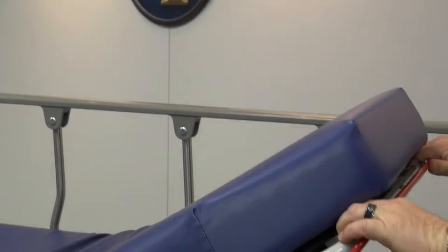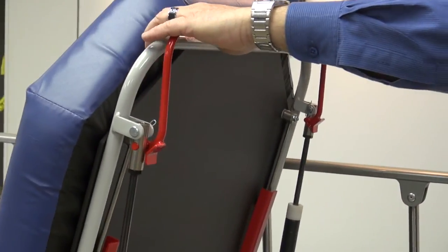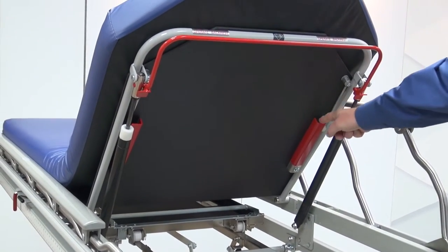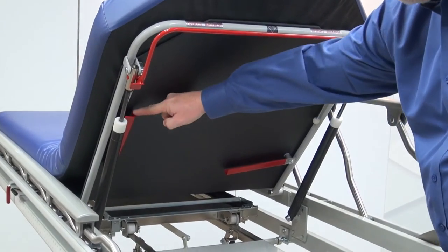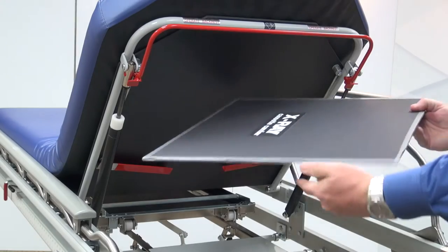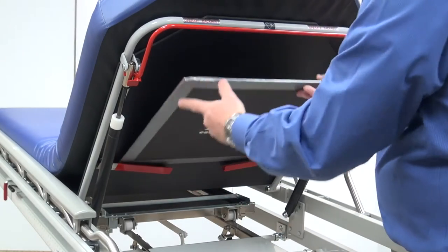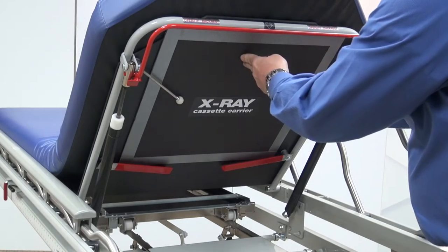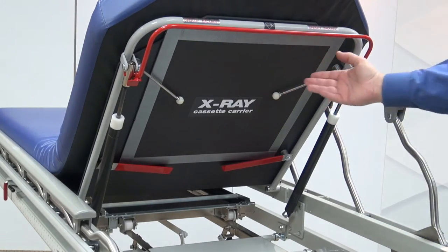The backrest of the stretcher is designed to be adjustable using the gas spring assist to help the caregiver raise the back with little force. The design of the X-Ray Trauma Stretcher will also allow the back section to hold a cassette for upright X-rays. The back will adjust from 0 to 90 degrees in a smooth motion.